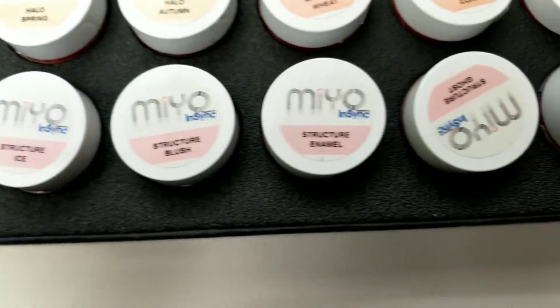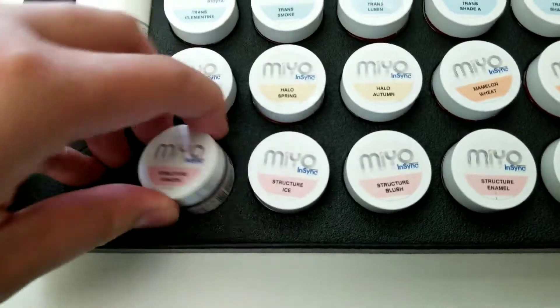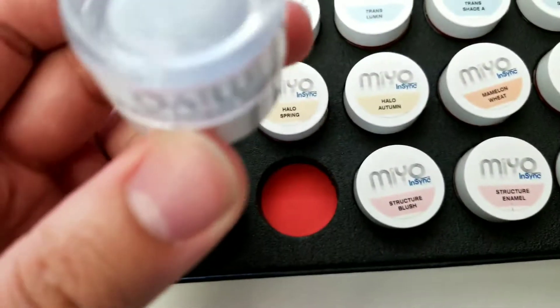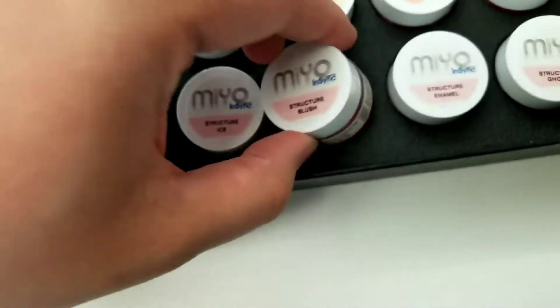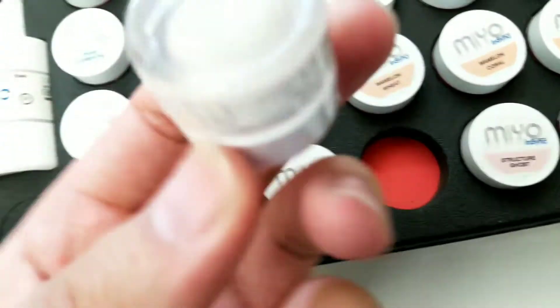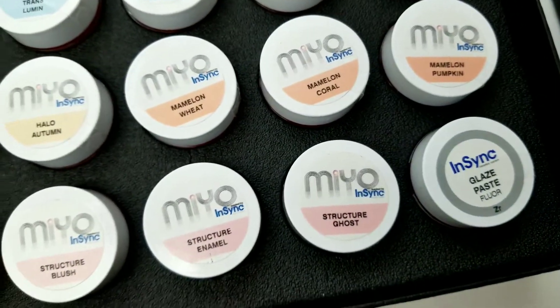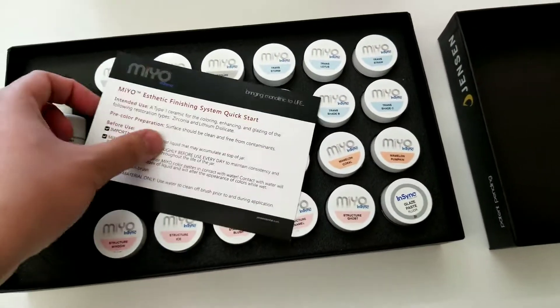And then you got Structure — this is really neat stuff too. This allows you to get texture and really build up. So if you want any kind of perikymata or mamelons, Structure is what you want to use for that. And your glaze paste. So yeah, that's the unboxing of the Mio kit.